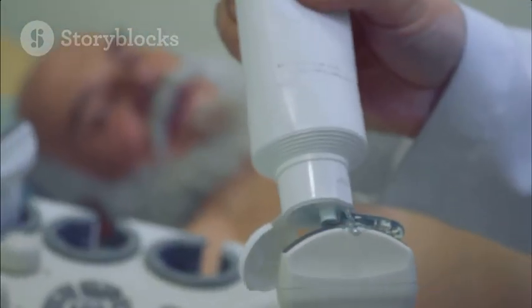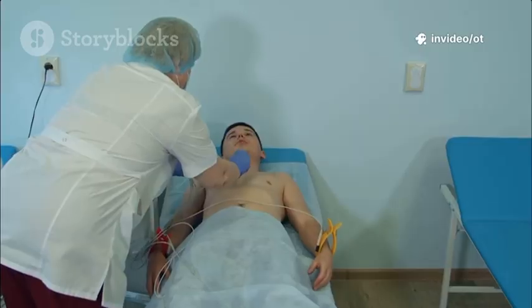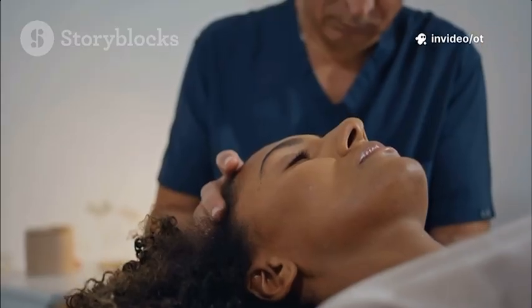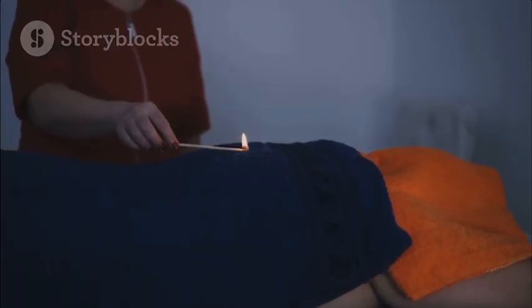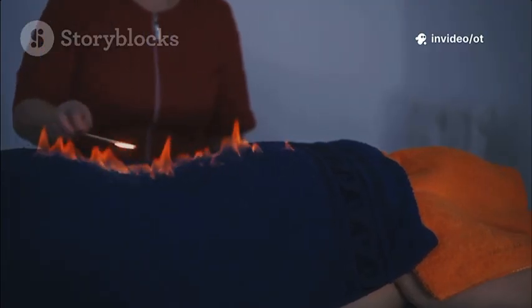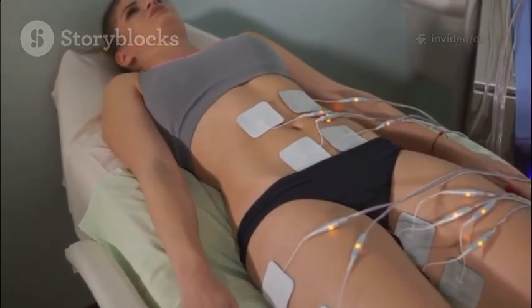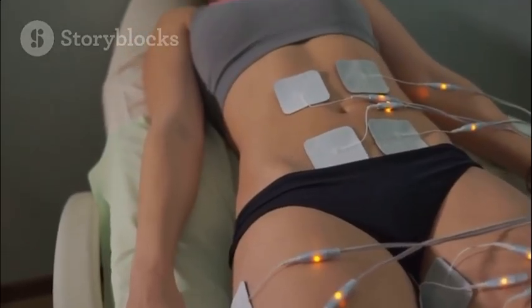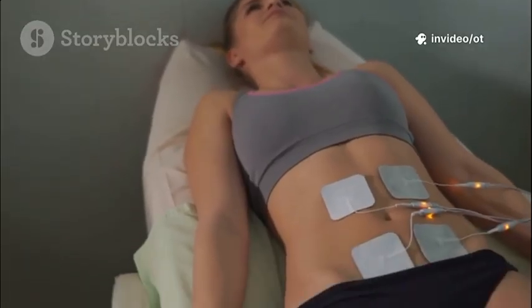Heat is an excellent preparatory modality for manual therapy, stretching, and therapeutic exercise. It's a simple but powerful tool for subacute and chronic symptoms. Indications are specific. Avoid the acute inflammatory phase. Most beneficial for subacute or chronic pain, persistent muscle tightness, and joint stiffness, for example, osteoarthritis. Apply heat just before range of motion treatments because increased extensibility allows greater gains with less discomfort. Example: moist heat pack on a stiff lumbar spine, then mobilization or flexibility exercises for chronic low back pain.